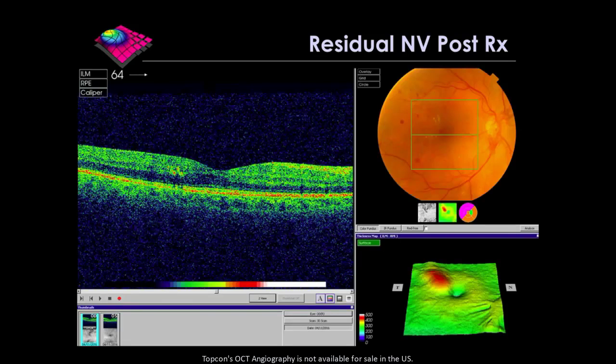This is the scan that she has done in the private clinic, the traditional 3D OCT scan. And you can see, and hopefully you can take my word for it here, but there's neovascularization at the disc. There's some hard exudates, but there isn't any frank diabetic macular edema.